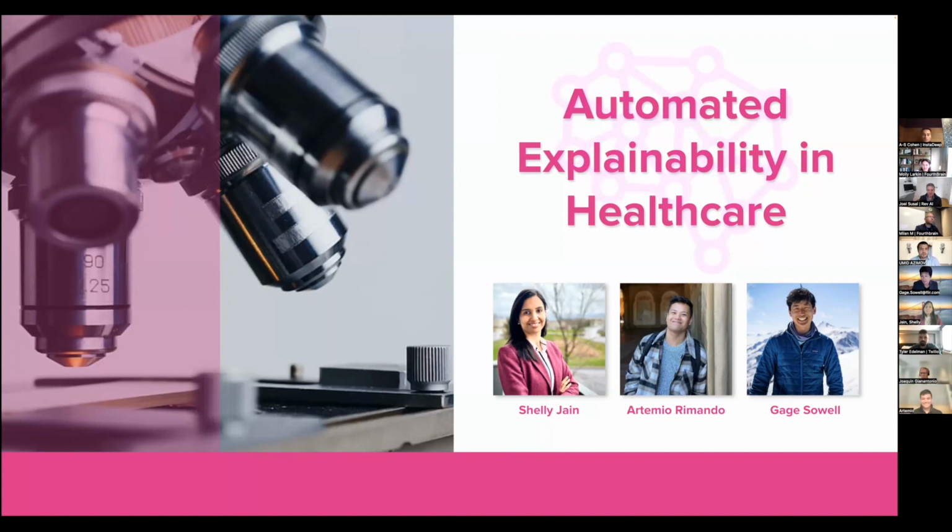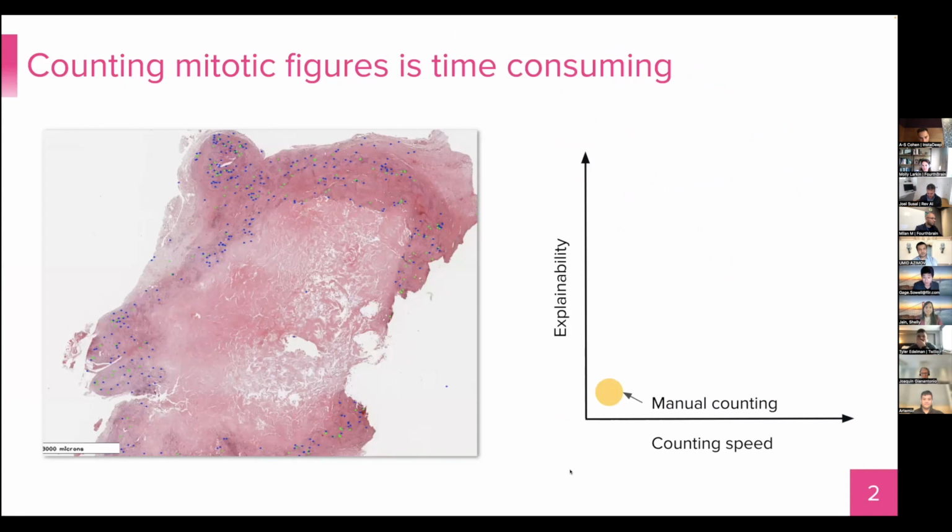Medical image interpretation and diagnosis are critical to driving quality healthcare, and tedious. Pathologists could be spending hours evaluating tissue images and making observations. AI can analyze this existing data and help with the diagnosis. One of the key barriers that AI in healthcare in general is facing is explainability. So today we are going to demonstrate an AI product prototype, which helps diagnose mammary carcinoma, which is presence of tumors in breast tissue, and also provides some explainability features.